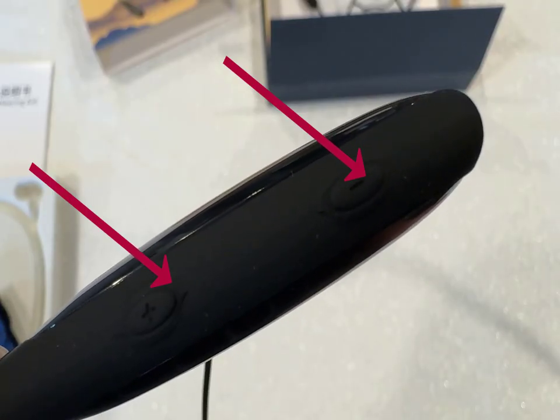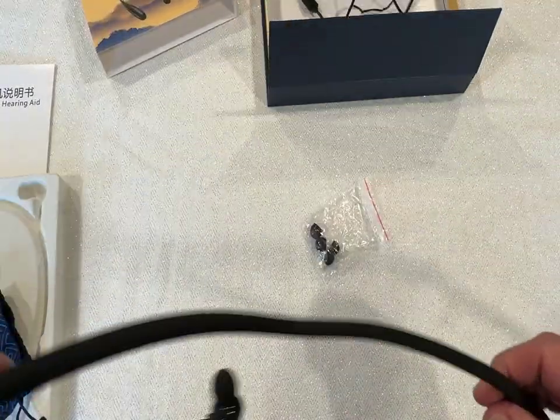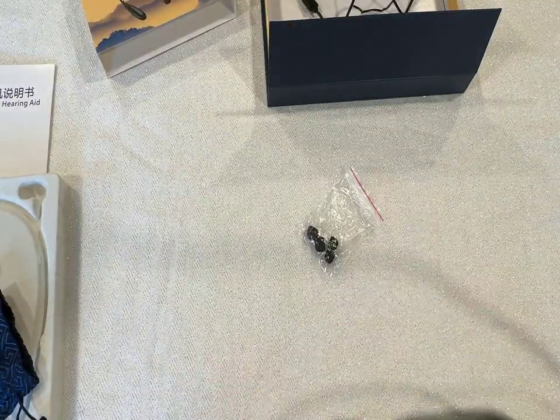Each side has independent volume controls with eight levels. The neck band is very flexible and comfortable. It has two modes: Bluetooth mode and hearing aid mode.